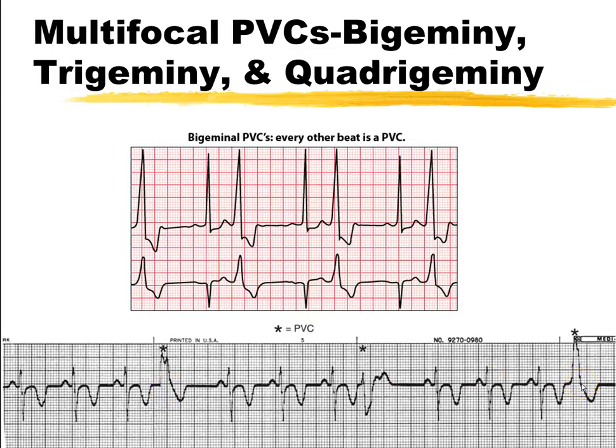You think, well, what's the big deal, really? If you have multiple areas of your ventricle that are trying to be excitable, trying to send out their own little impulse, be the pacer of the heart, it gets to be problematic because the more areas of excitability you have, the more chances you're going to have of a total disruption in the normal conduction pattern. And these crazy areas of the heart may just take it over, and you're going to end up with another pattern that I'll show you later on.